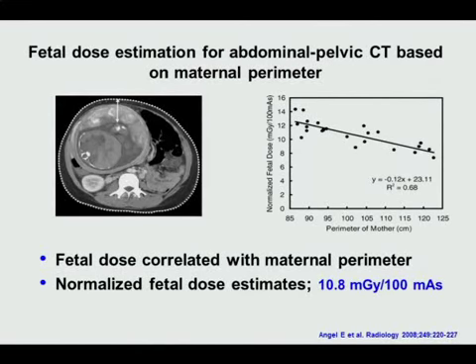As I said, in radiography, fluoroscopy, CT, or any one of these procedures, if the primary beam is not focused on the abdomen and pelvic area, the fetal exposure is almost insignificant, almost equal to background radiation, purely because of the internal scatter. And the calculation is needed only where a more detailed calculation is required, when the protocol involves the fetus directly in the path of the beam.